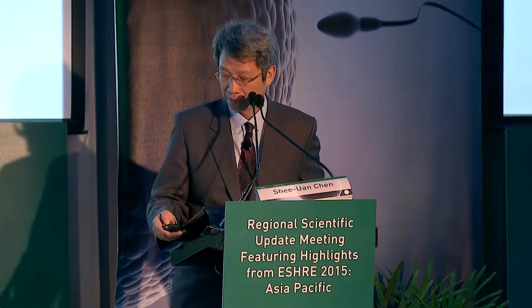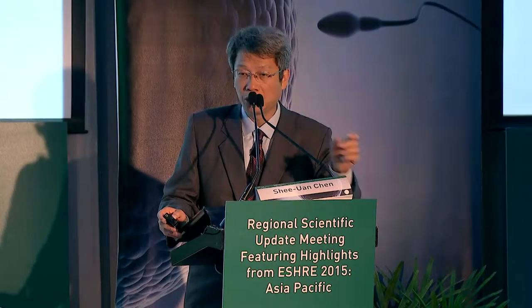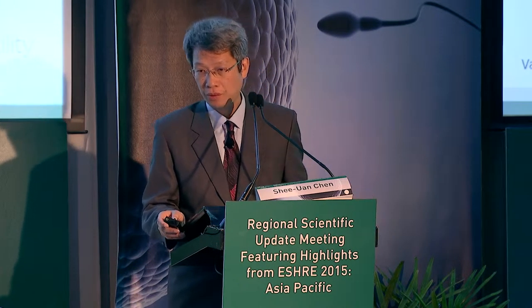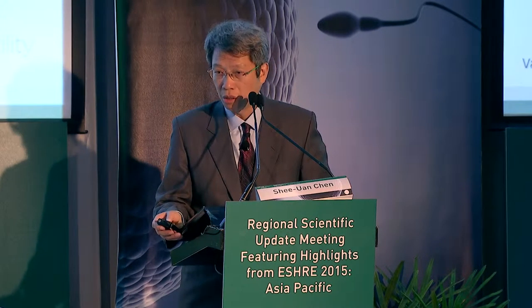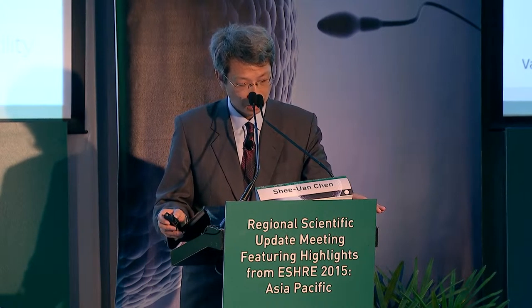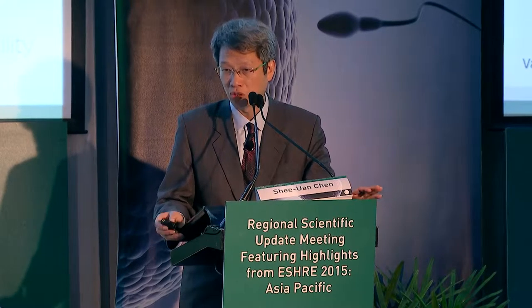Then we talk about the closed system and open system for vitrification. These papers investigate the clinical outcome of day 2, day 3, or day 5 embryos vitrified with a closed system. Vitrification is used for cryopreservation of surplus embryos, or as a freezing strategy for risk of ovarian hyperstimulation or impaired endometrium pattern. The closed system and open systems are now available commercially.